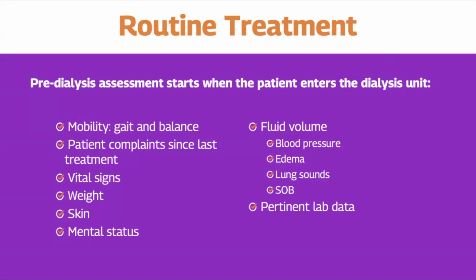We evaluate and assess their mental status and fluid volume. We look at blood pressure, edema, lung sounds, and shortness of breath, and sometimes even look at pertinent lab data, especially if they recently had labs.